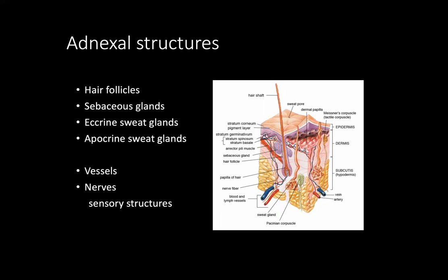And this does not even talk about the inflammatory component, which includes different cell types. And so as you can imagine, DermPath has a lot of representations of normal derivation turning into abnormal, and you have to know the normal first before you can understand the abnormal.